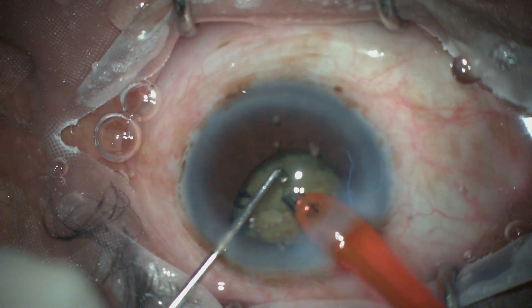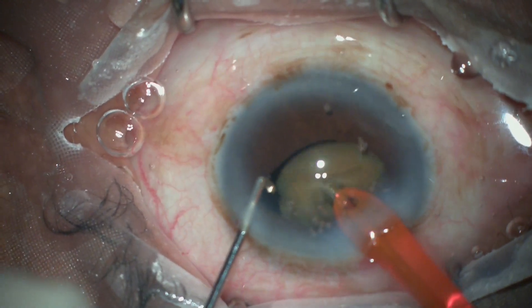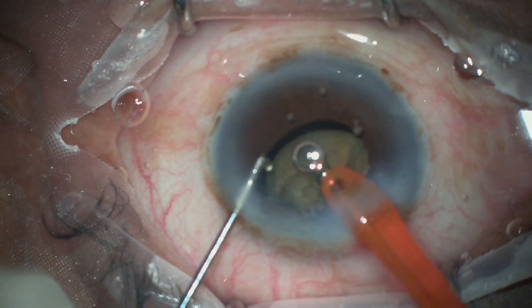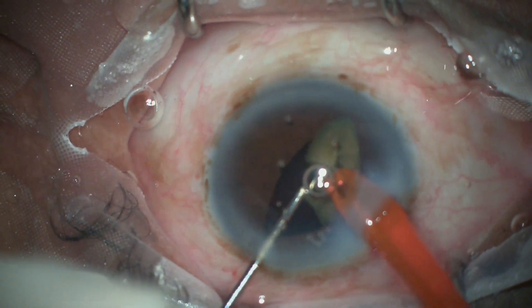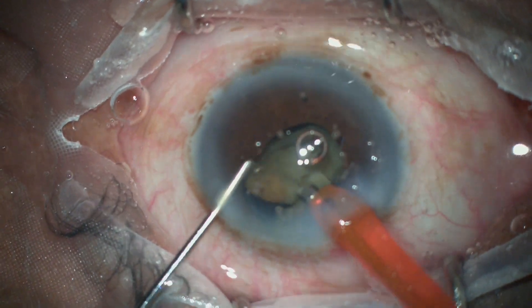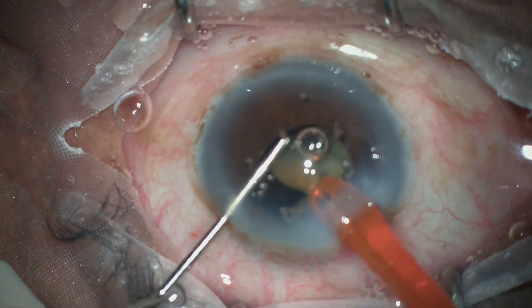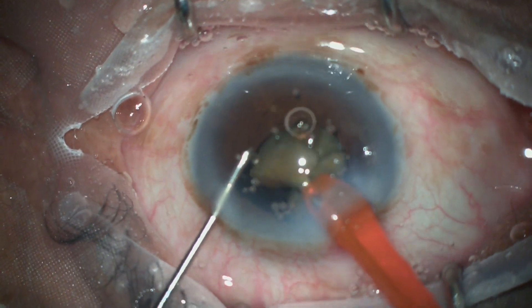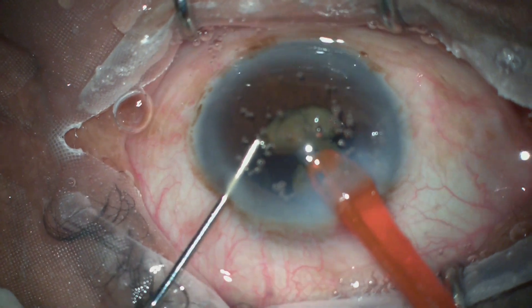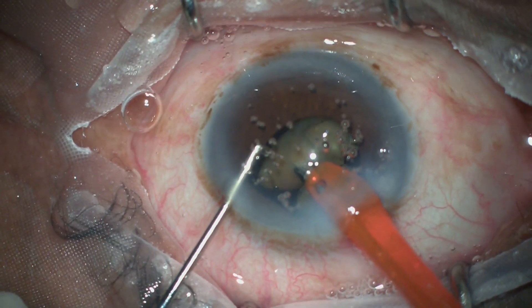The problem persisted until I realized that switching to micro-pulse mode would neutralize the repulsing effect of the phaco tip. The job became easier, and you can appreciate exactly where this transition happens. The moment I switch to micro-pulse mode, the pieces are no longer being repelled — rather, they are being attracted.